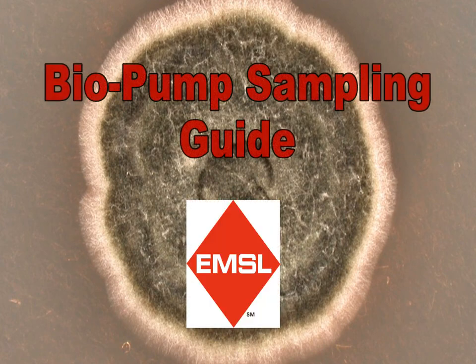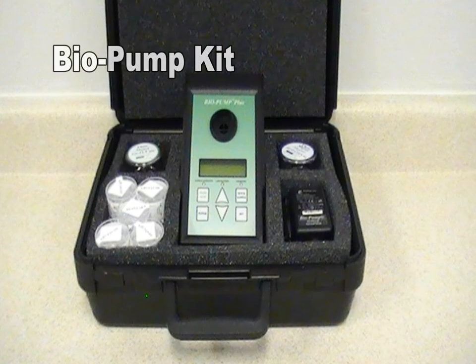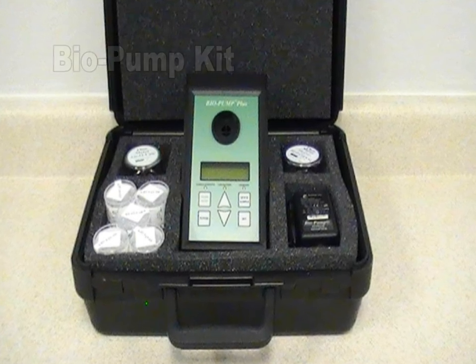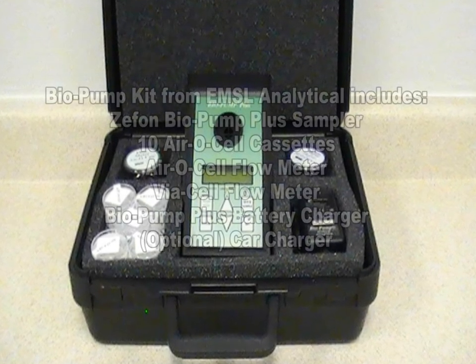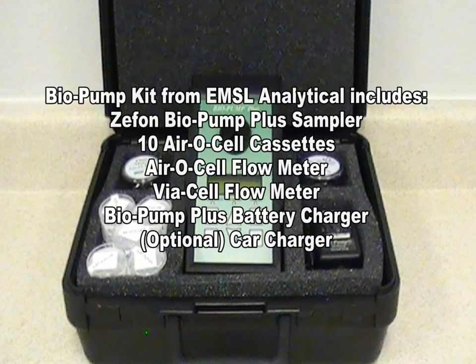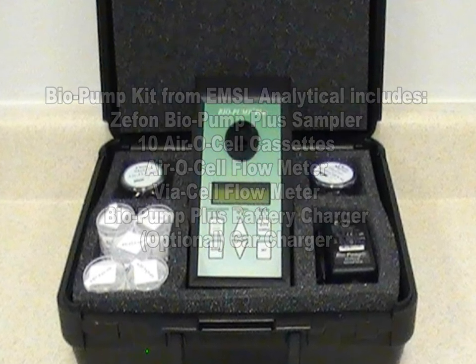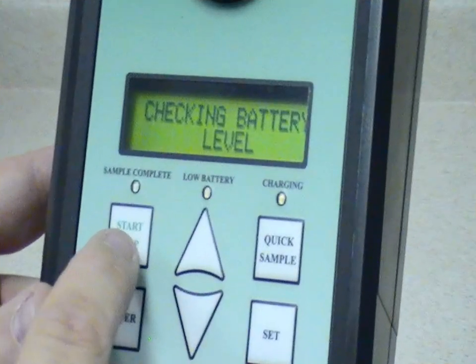Welcome to EMSL's product videos. The Biopump Kit from EMSL comes complete with the Zefon Biopump Plus Sampler, a 10-pack of Aerosel Cassettes, the Aerosel Flow Meter, a Viacel Flow Meter, the Biopump Plus Battery Charger, and there is an optional car charger.